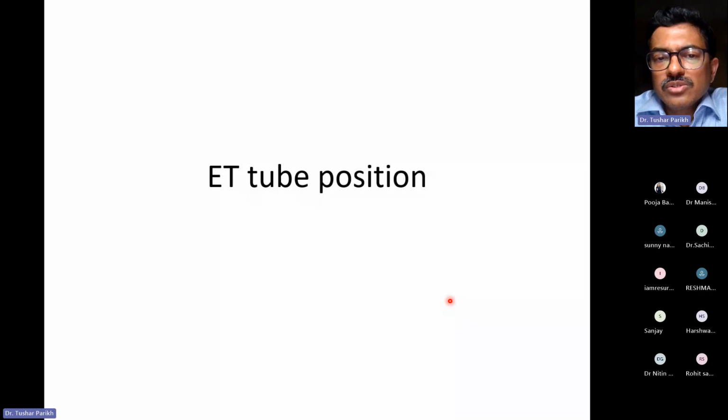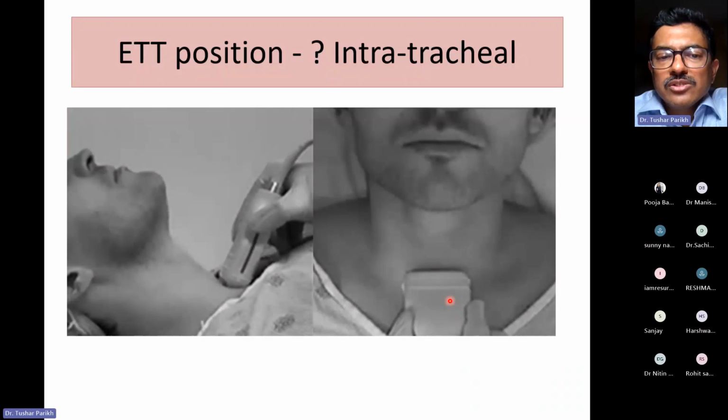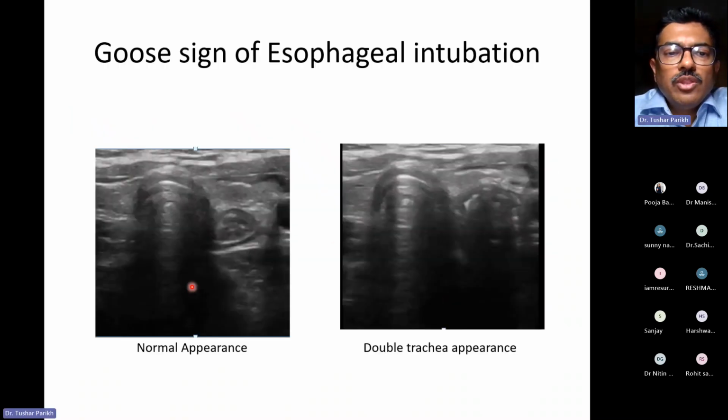So for that, there are two different ultrasounds that we have to do. Now this is the one ultrasound where you use the linear probe and you put it on the cricoid cartilage, and you look for normal appearance, which will be like this. This is the tracheal cartilage, and because it is a cartilage, it casts a shadow. Also inside there is air, and therefore this particular structure will be seen like this, and then there is acoustic shadowing, and you are not able to see anything beyond that because of the cartilage and because of the air within. And to the left of that you have a collapsed esophagus.